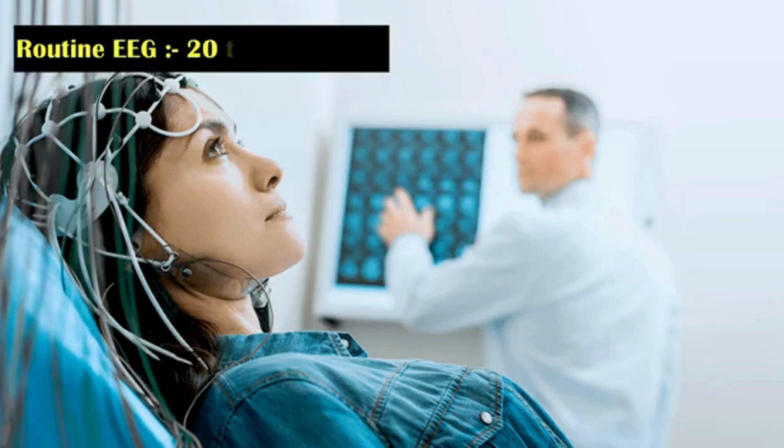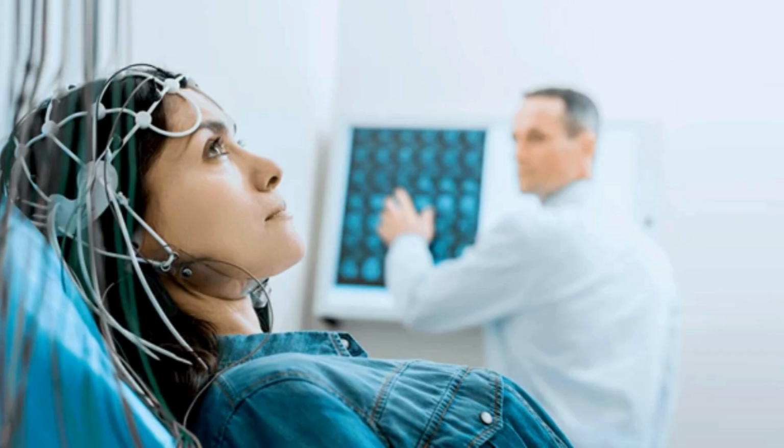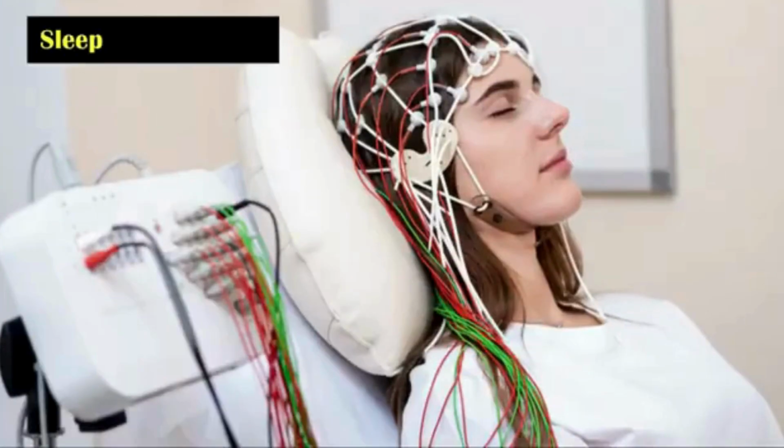A routine EEG recording usually takes around 20 to 40 minutes. Patients are asked to rest quietly during the procedure and open or close eyes from time to time. In most cases, they have to breathe in and out deeply for a few minutes. At the end of the procedure, a flashing light may be placed nearby to monitor the brain activity with the light.